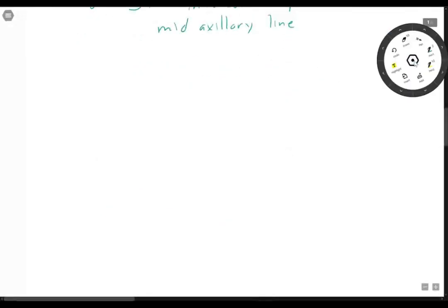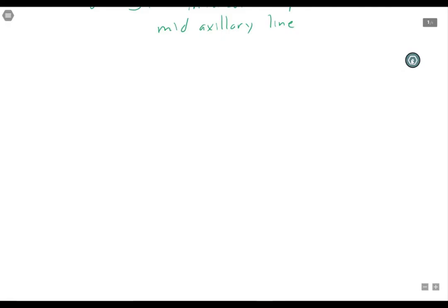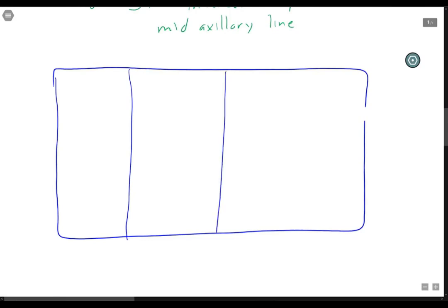And what that ends up giving us are 12 views now of the heart. And so when you get your ECG printout, you can get it so that it looks like this, and it will.